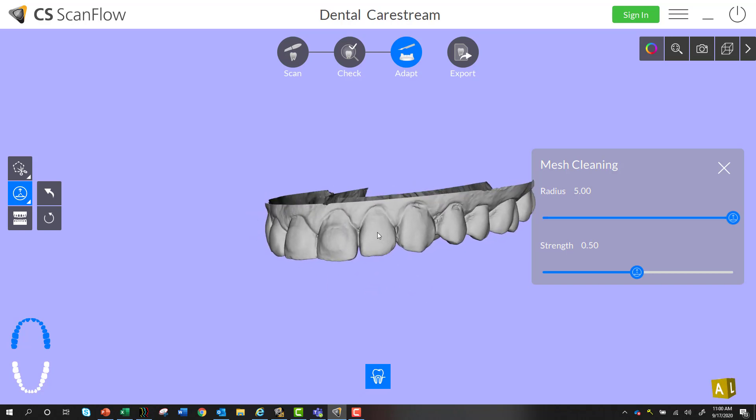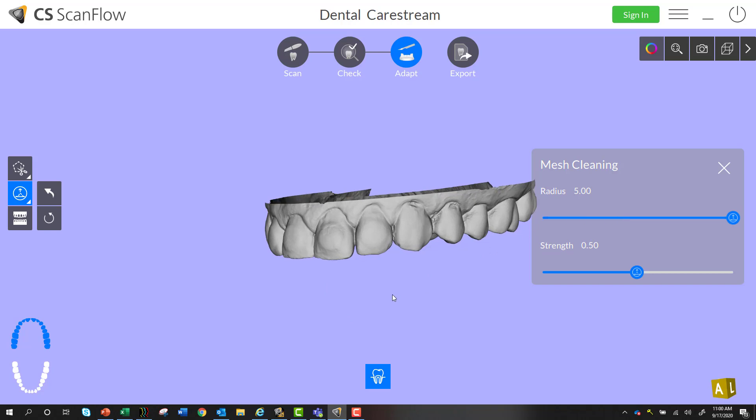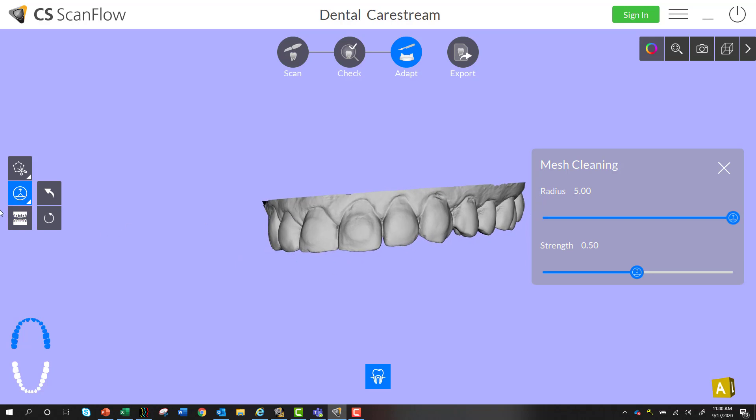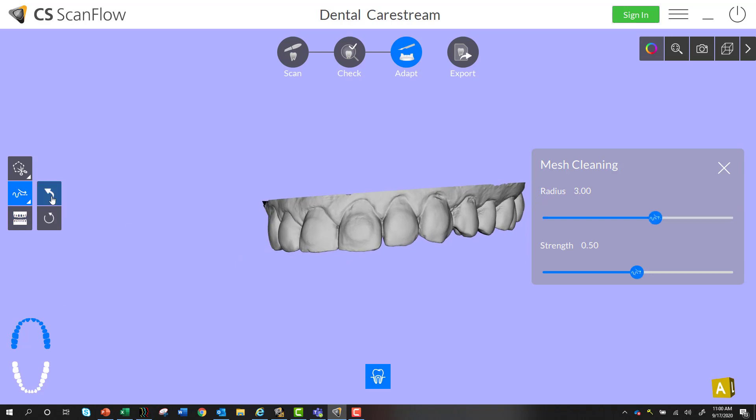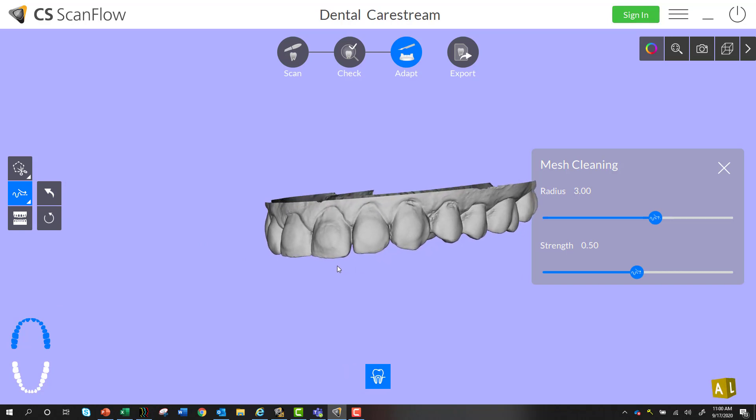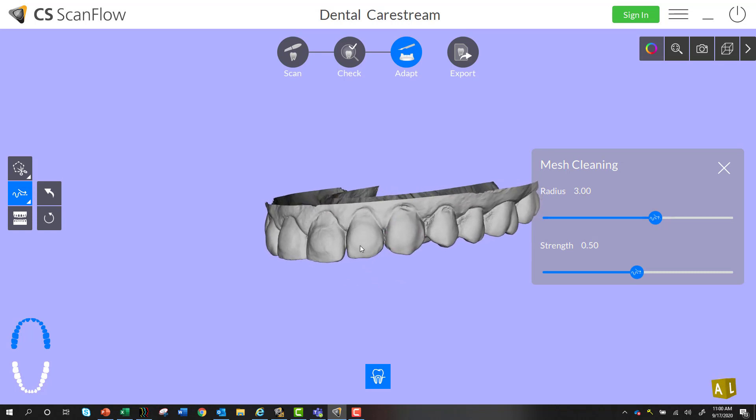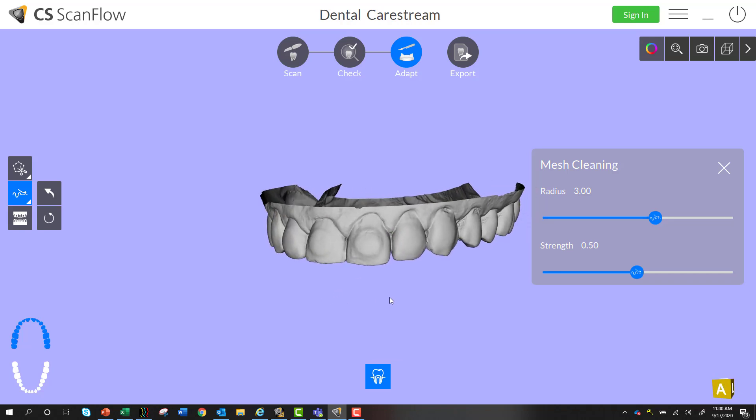You can certainly fine tune the block out area to your liking if you wanted to get a little bit more specific in the area, but that's totally up to you. Next I can change this tool to the smoothing feature and then I can smooth out each area nicely on each tooth. Also if you increase the area a little bit too much you can use the smoothing feature to smooth it down and that will also help decrease the area.